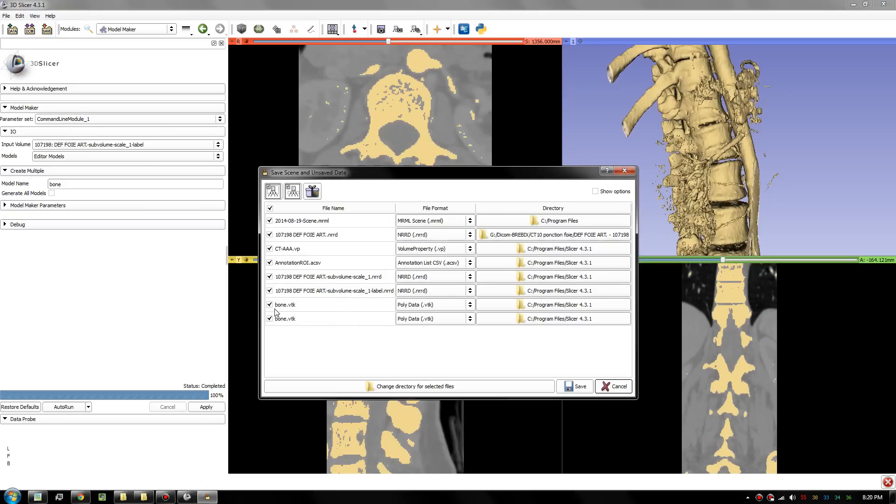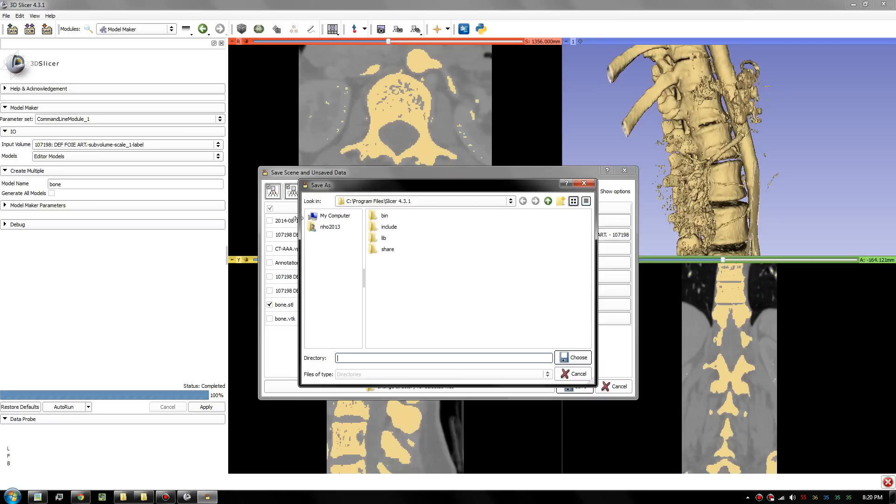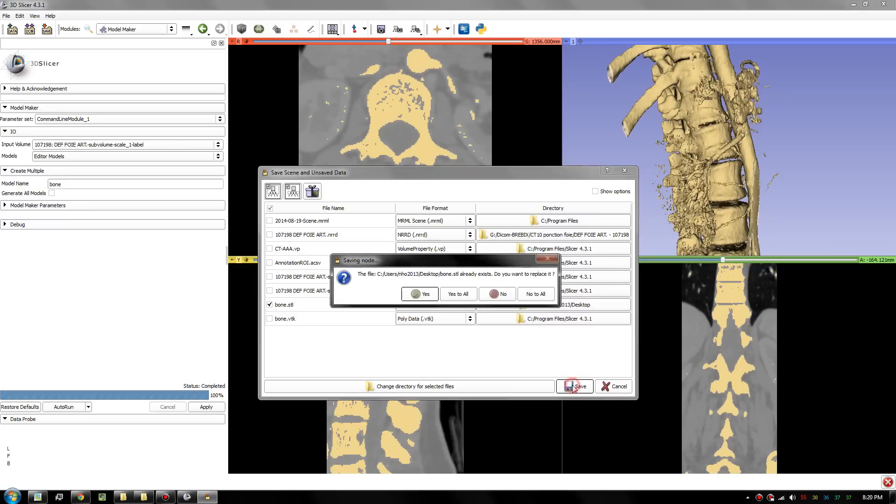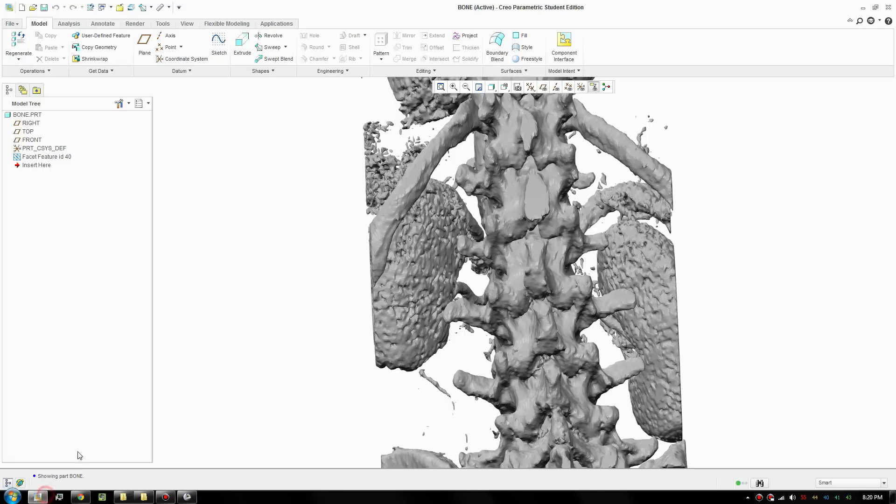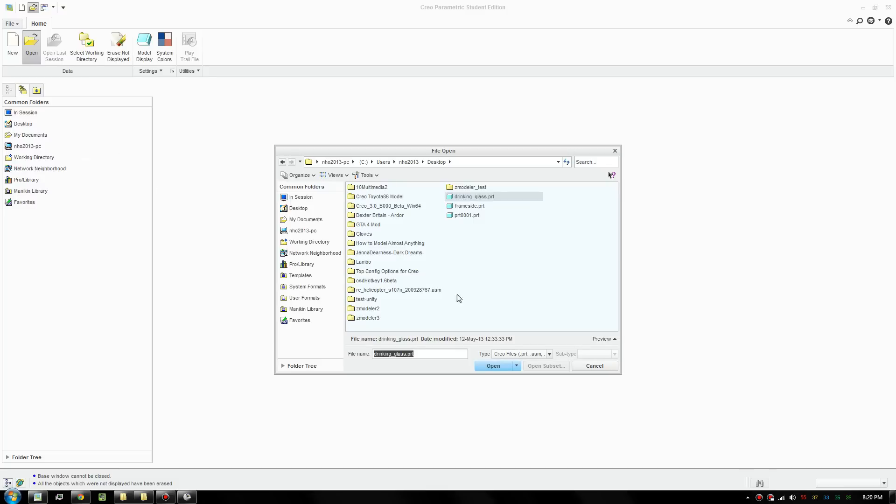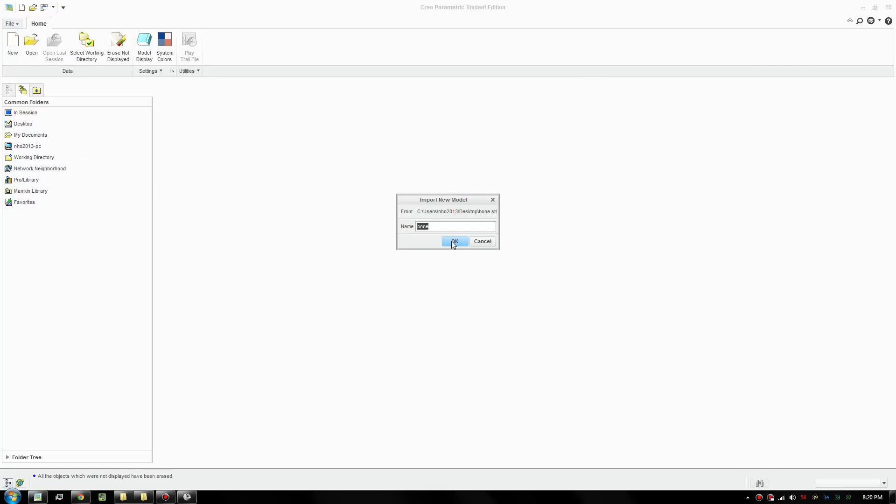Once you do that, you have this bone VTK. We will just load the bone. Tick that only, switch it to STL. I will click where you want to save it. I will save it to the desktop. Choose that, click save, and just replace. Go to your 3D CAD software, just go to open, go to your desktop, switch it to STL, and we can load in the STL file.